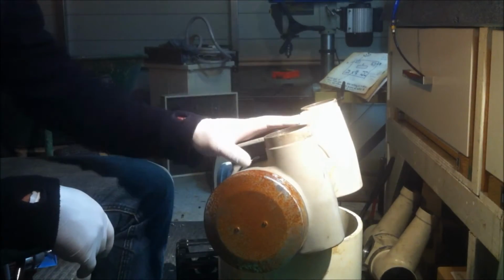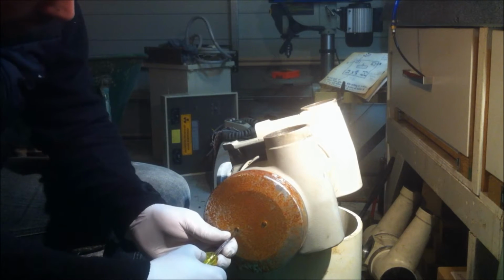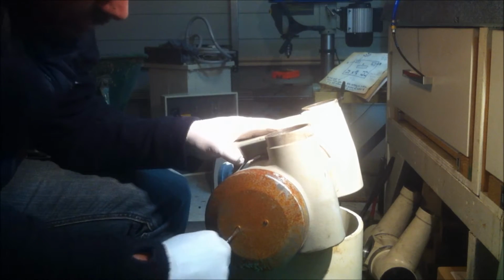Okay, I've done the small x-ray head, now we're doing this larger one. So we'll start taking this apart.